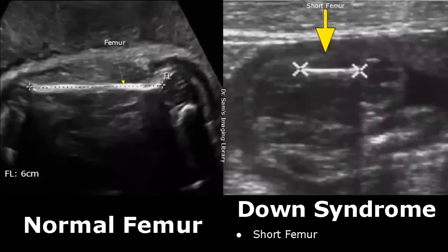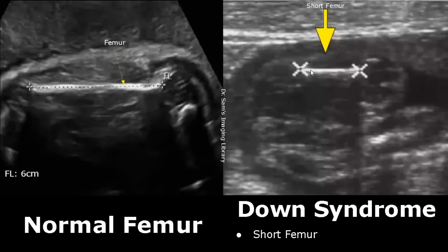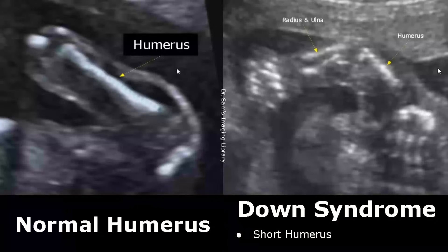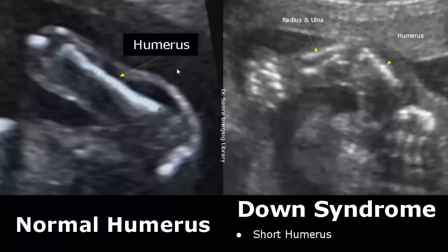A short femur is diagnosed when the femoral length is short for gestational age. It is associated with many congenital anomalies and can be seen in a fetus with Down syndrome. A short humerus is also associated with Down syndrome — the humeral length is short for gestational age, and it is often seen in a fetus with Down syndrome.